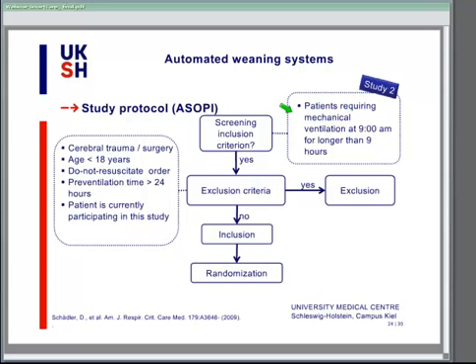The only inclusion criterion that we used was that every patient requiring mechanical ventilation at 9 a.m. in the morning for longer than 9 hours may possibly be included in the study. And this is the map of our practice, because normally all our patients, these are only post-surgical patients, were extubated during the evening or during the night. When a patient does not have a real serious problem, the patient will normally be transferred to the normal ward, and every patient who is still on the ventilator at this point in time may have some problem. We were interested whether the system may be quicker in weaning the patients when we started it at a very early time point.